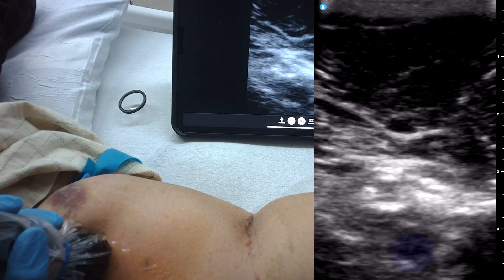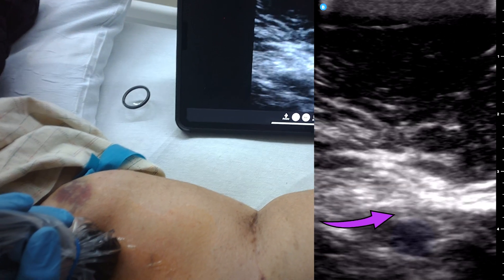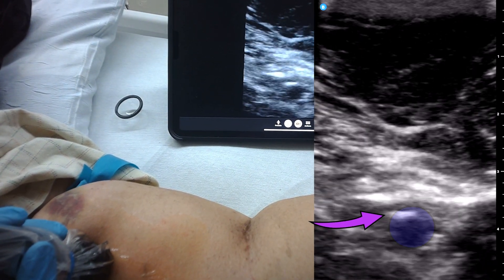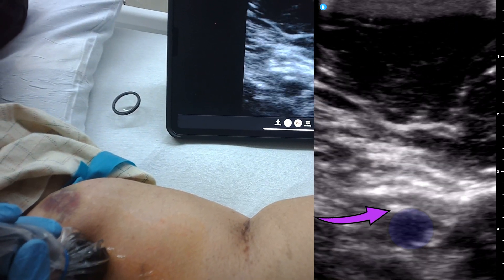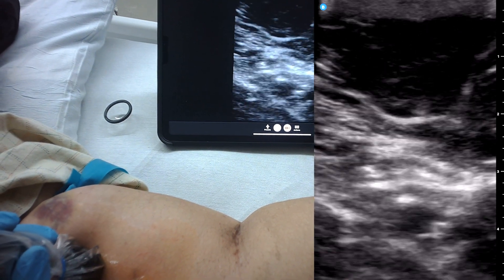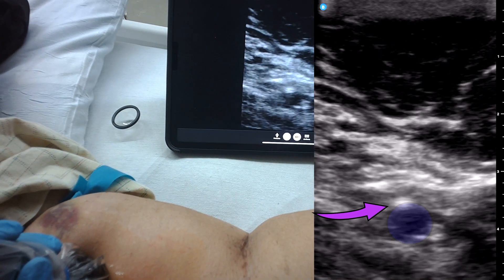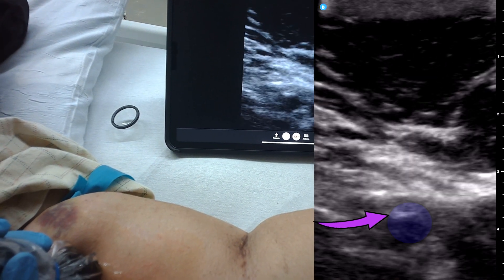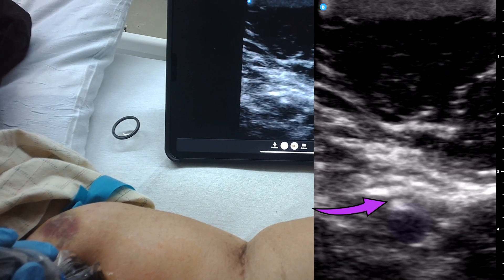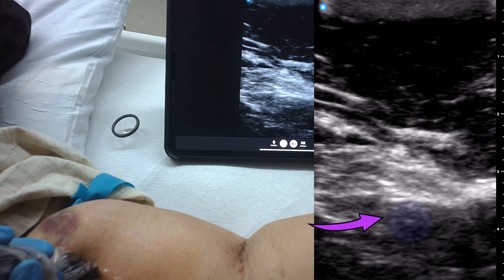How does that feel there? It's okay — bearable? Yes. Basically the arm is just tired from being held in this position. I advanced until I saw the bounce, which is right above the vein right here. Now some of you asked: how do I know I'm above or below? Do you see that extra white piece right above the vein that's moving up and down? Especially right there — that's the tip. Now it hasn't punctured yet; it's about to be punctured.